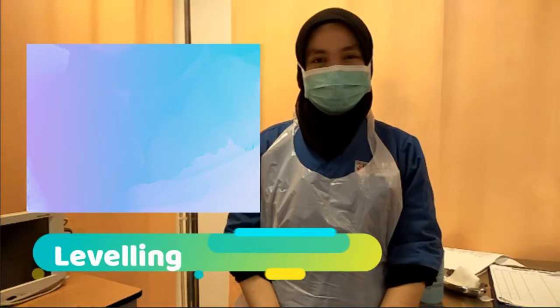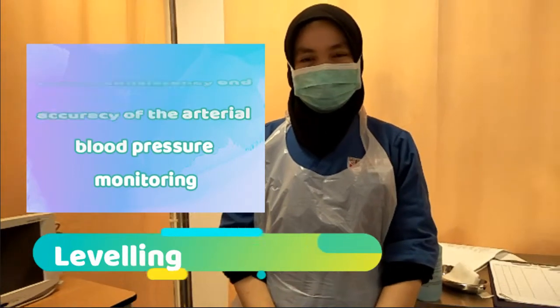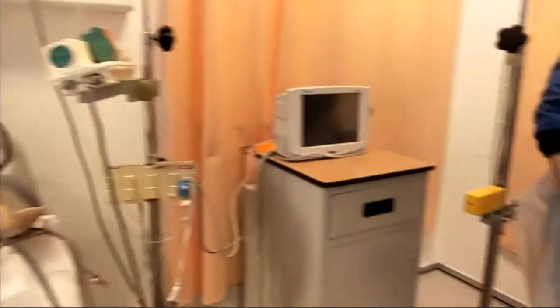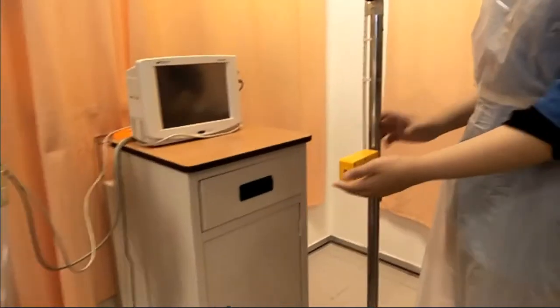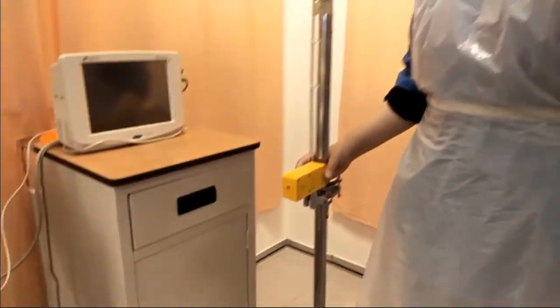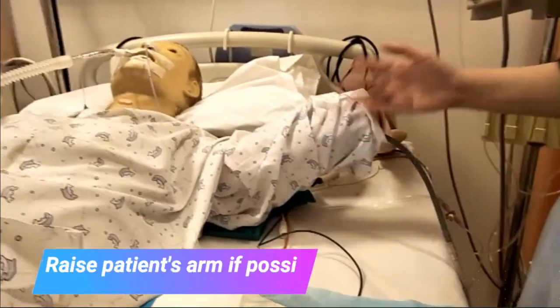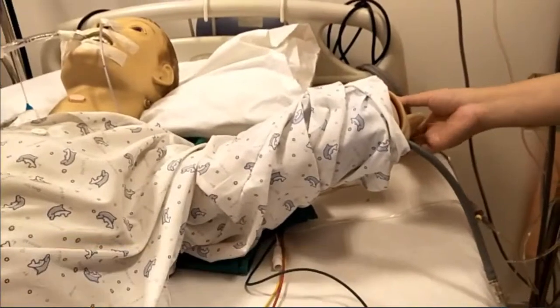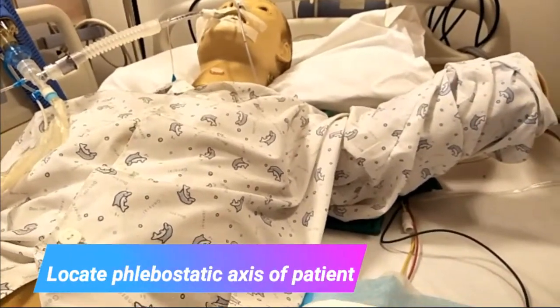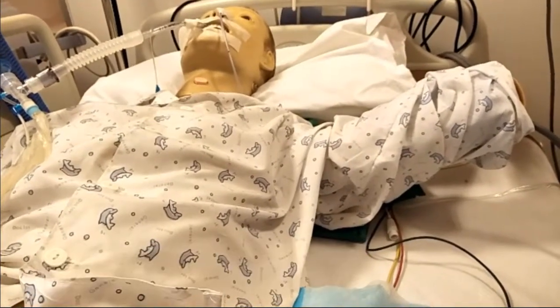The purpose of leveling and zeroing is to ensure consistency and accuracy of the arterial blood pressure monitoring. To perform an arterial line leveling procedure, we will need a pointing laser. First, ensure the patient is lying flat on bed and, if possible, ask patient to raise arm. Locate the phlebostatic axis on the patient, which is the point on the chest that represents the position of the atria and therefore reflects central blood pressure.